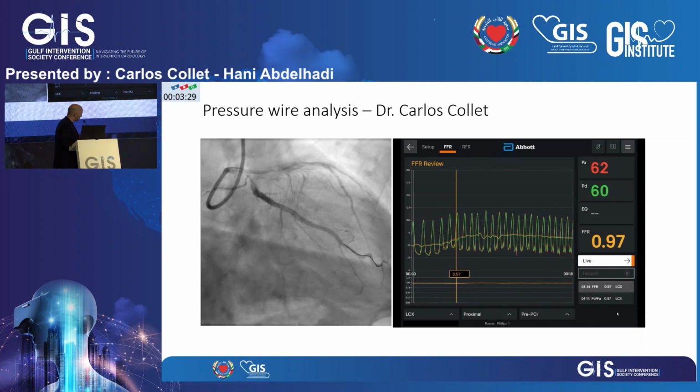And exactly what you said. So here the FFR might be high and falsely high, let's say. Yeah. Maybe I had a question about FFRing the circumflex coronary artery, like smaller territory of myocardium and so on. I rarely find it becoming positive unless it is really a critical lesion. I don't know if you notice the same, if you want to comment about that.